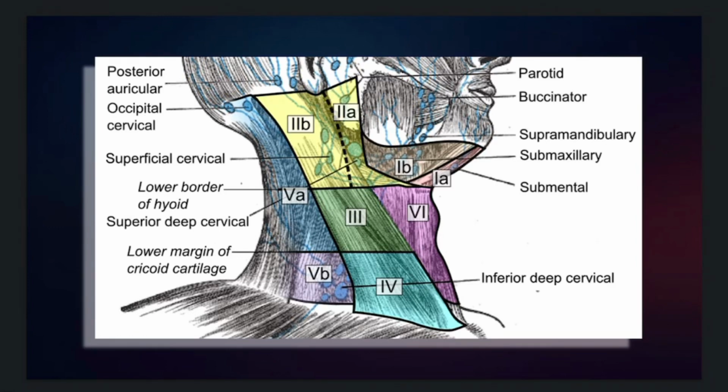Today, let's go over the neck protocol. So the other day, I did a video on thyroid protocol. This is going to be more in depth of the neck. This exam is usually ordered as ultrasound head, neck, soft tissue.